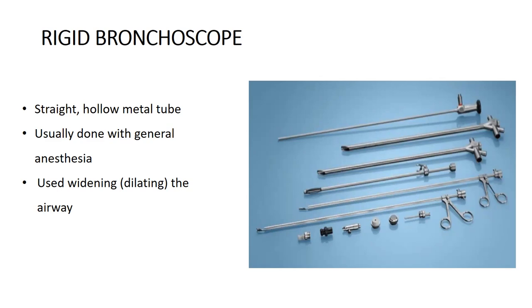There are few patients in whom we do spray tissue fibrin glue and other materials, and you can do it only when you have specifically noted a segmental or a subsegmental bronchus. You cannot generally spray a glue or a foreign material into a lobar bronchus because you are obstructing that lobar bronchus, which results in secretions being pent up and getting infected.